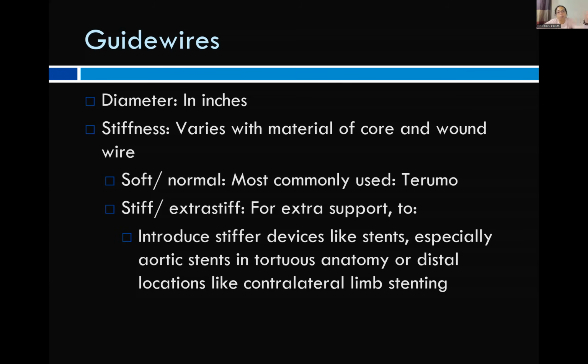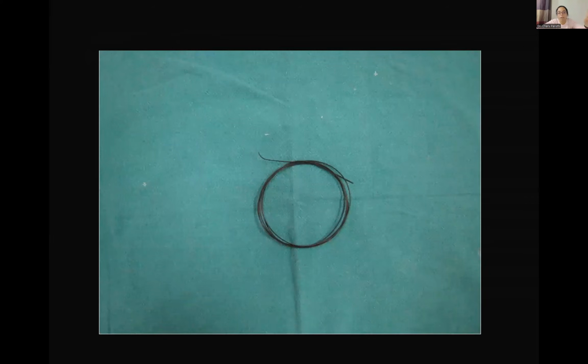working, we should always have one end of the wire in our hand. But if we are removing the catheter, then the wire will go in the catheter and it can be lost inside the body. So we use very long wires over which the catheter can be removed. So if we want to exchange the catheters, the length of the wire should be more than double the length of catheter, so that some part of the wire is always in our hand.